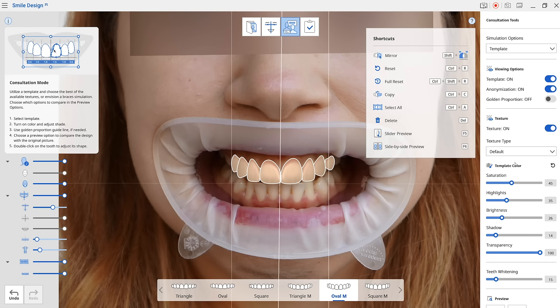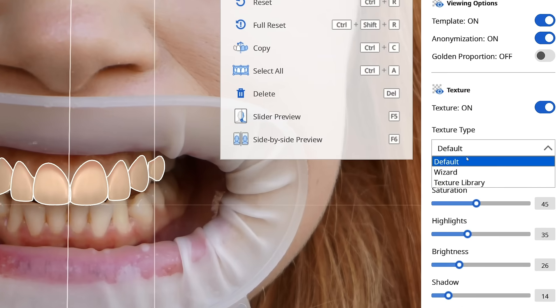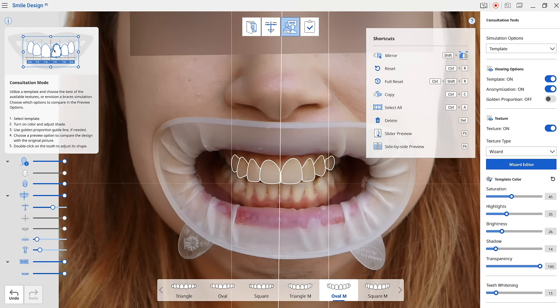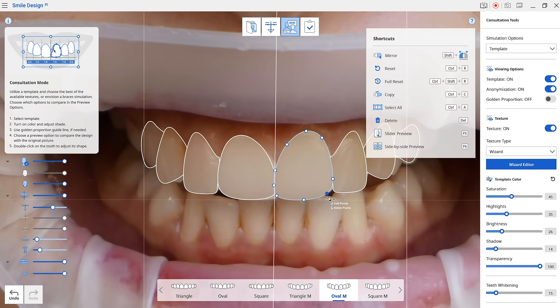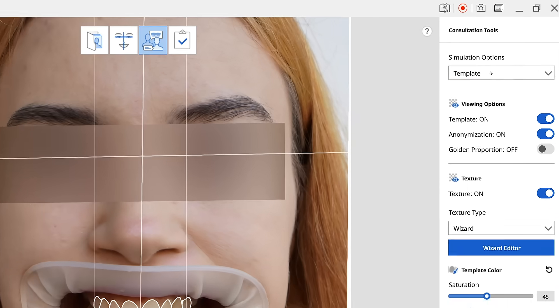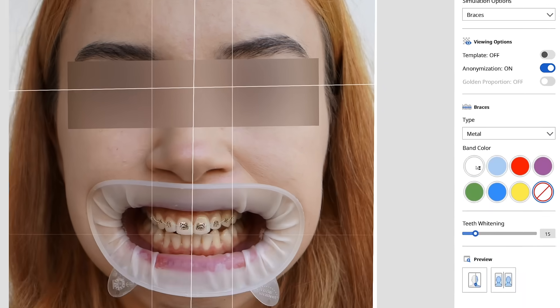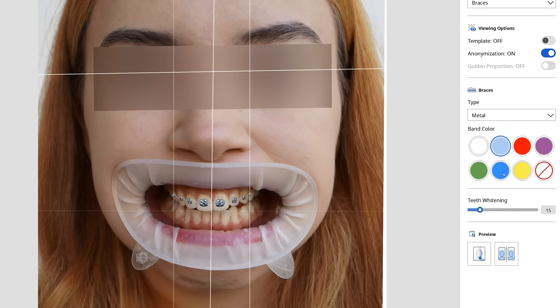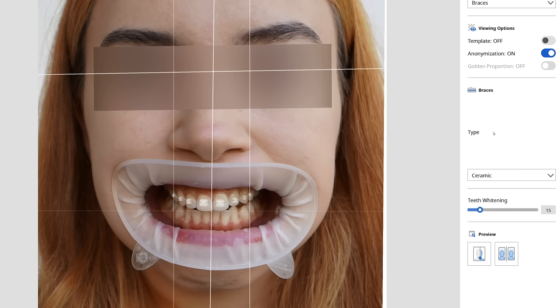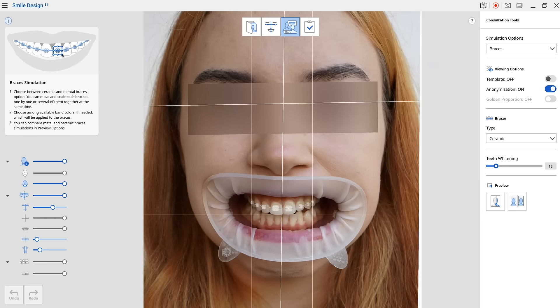We love some magic here at Medit, so we're introducing the Texture Wizard. This wizard will automatically create a texture that matches the texture and shade on the image. Way to impress your patient! Great news for you, masters of orthodontics! We added a braces simulation feature which helps your patients make sure that they will still look beautiful during the treatment. Choose between a metal and a ceramic option, choose the elastics color, and you're good to go!